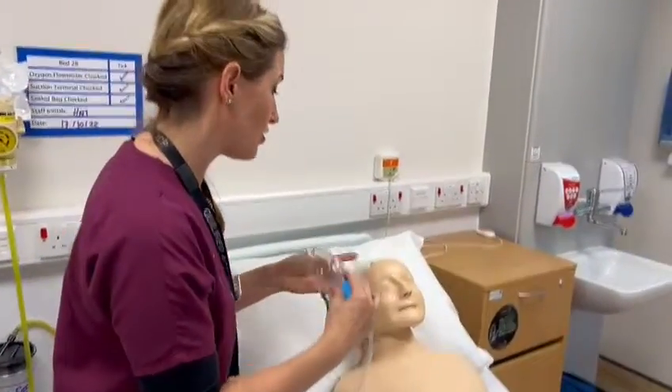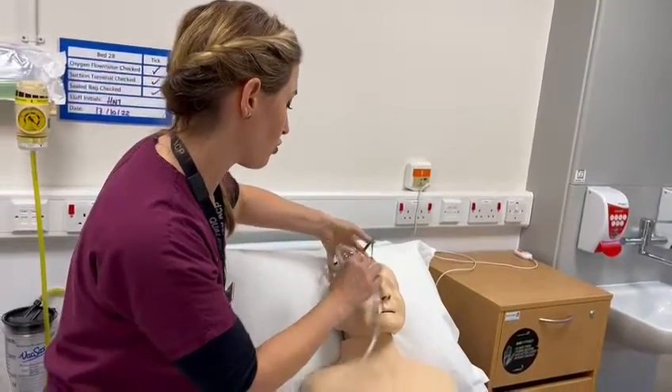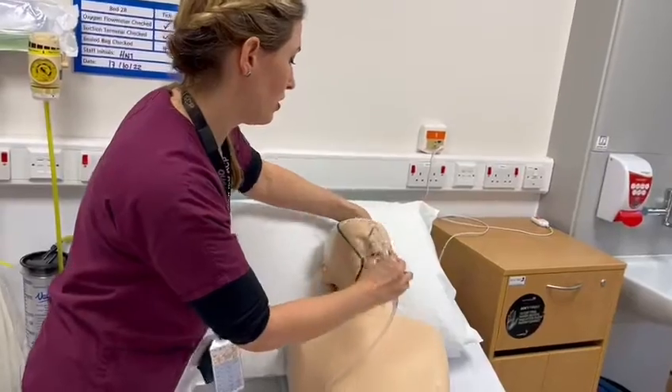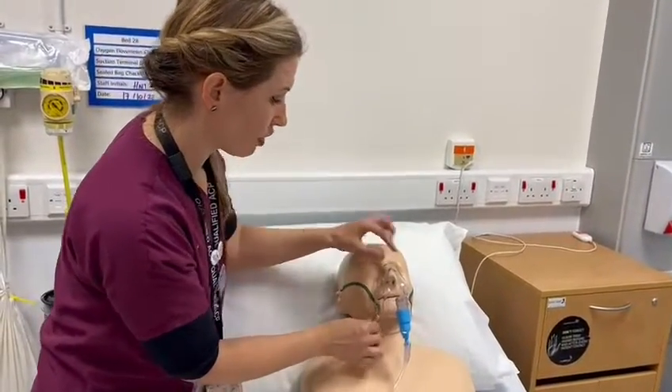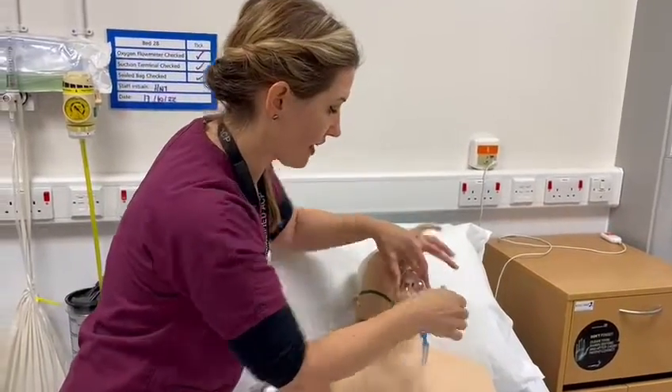Explain to your patient what you're going to do: 'I'm just going to pop this oxygen mask on — it may feel a bit strange, but it should just make you feel a bit more comfortable.' You just pop that onto your patient, you've got your elastics here, and you can just tighten them around the face.